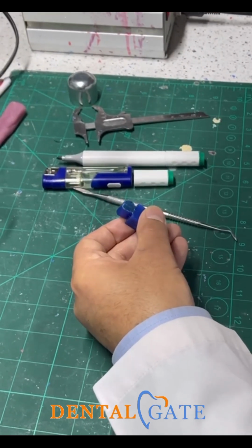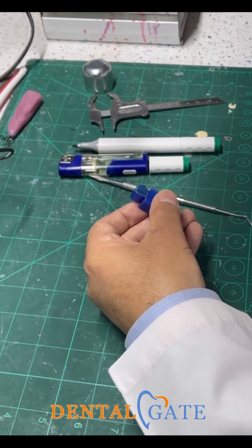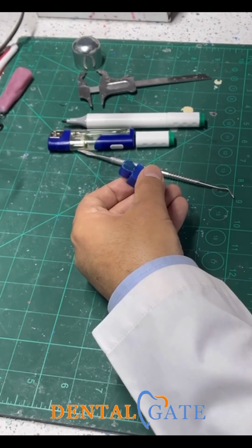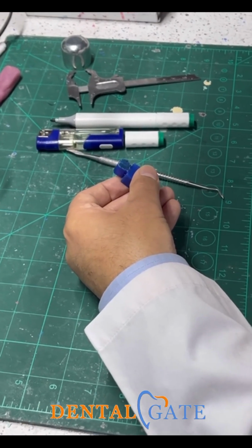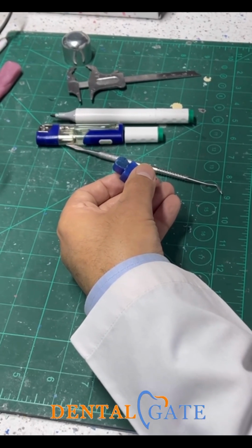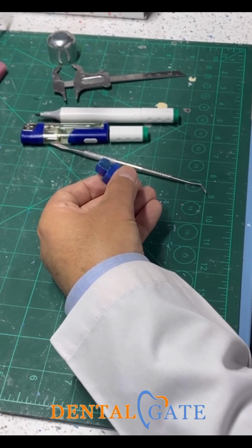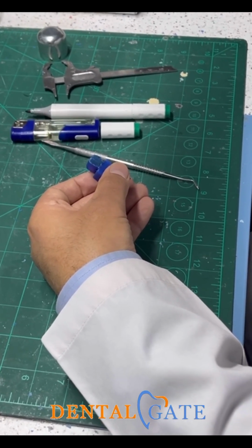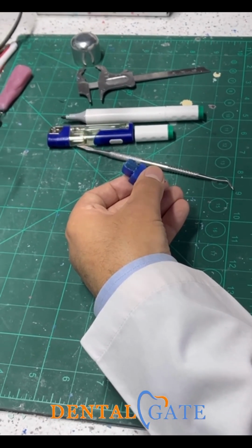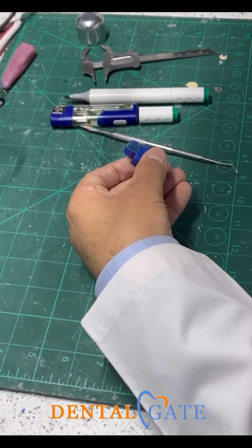You can see here in our reference for the lateral incisor, we have a rounded shape. We don't have a sharp angle like in the central incisor. And you can see this is the distal aspect, this is the mesial aspect. The distal and mesial aspects are slightly convex, okay? So we have a severe roundation here at the mesial. This is the contact area.